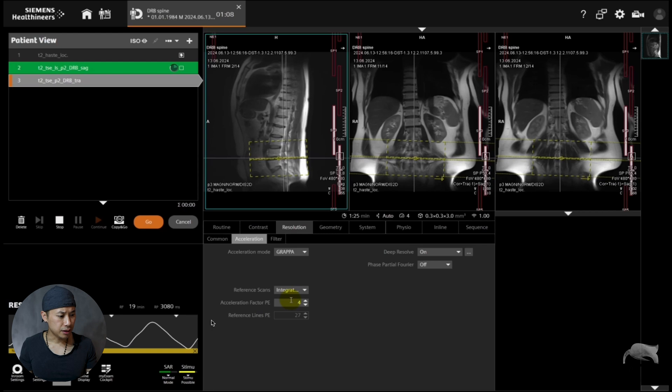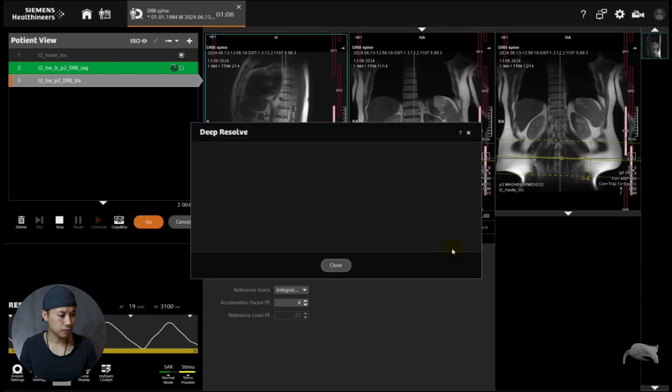With integrated mode, as you can see, I have an acceleration factor of four — that's a very high acceleration, which is unusual if you're not using Deep Resolve. If you push this button you can see boost is on and sharp is on. Another thing is the denoising stripe; you can choose between low, medium, or high. Whenever I'm using integrated, I tend to stay at medium, and I will show you why.